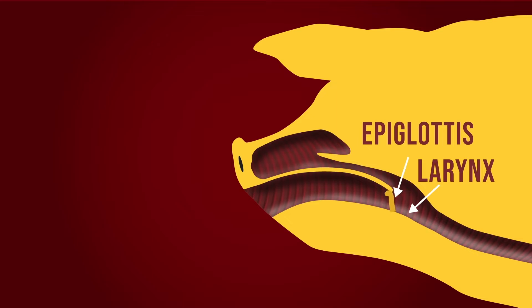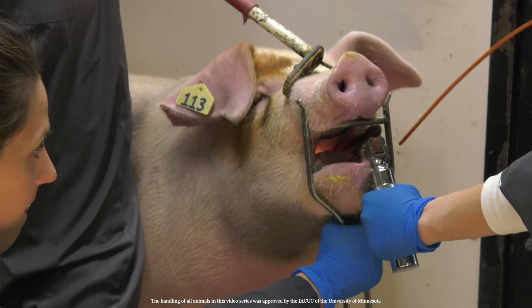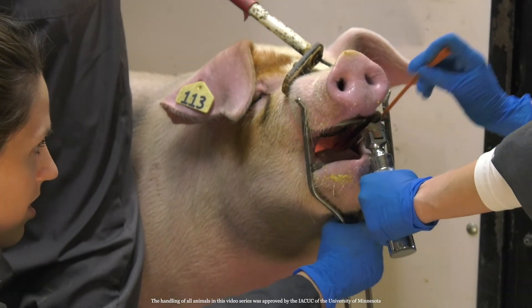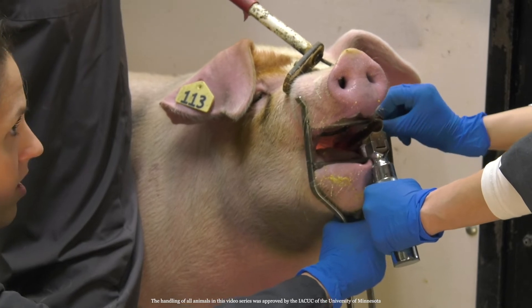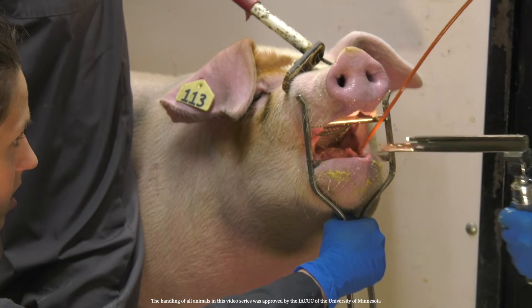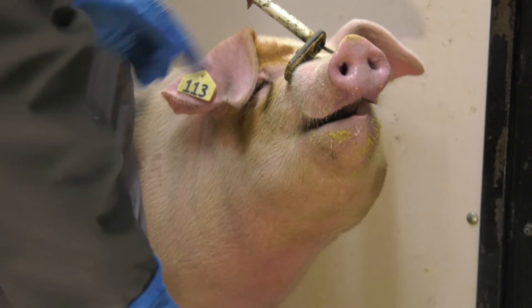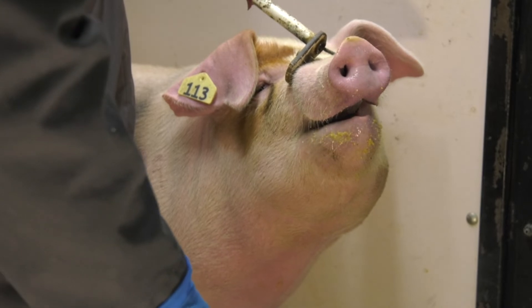The epiglottis must go down to see the larynx opening. As the catheter passes the larynx, you will hear the pig's squeal change in pitch. It's possible the pig will be quiet and not squeal at all. Be careful not to insert the catheter into the esophagus.